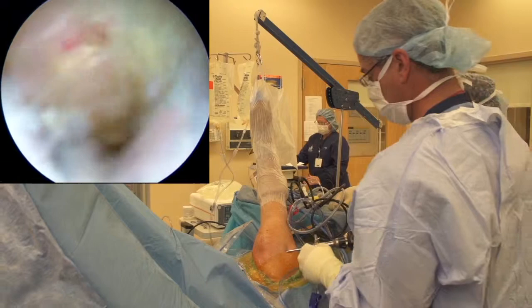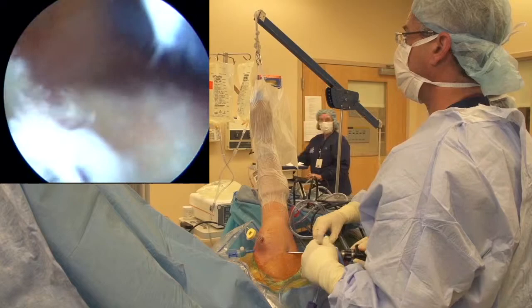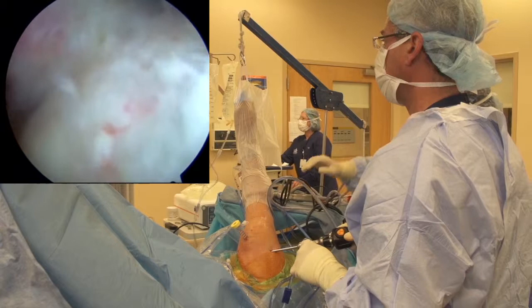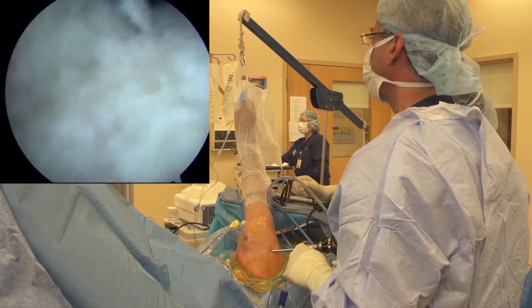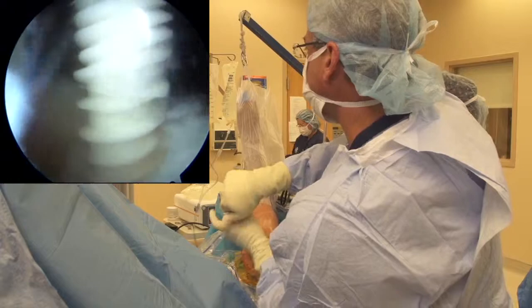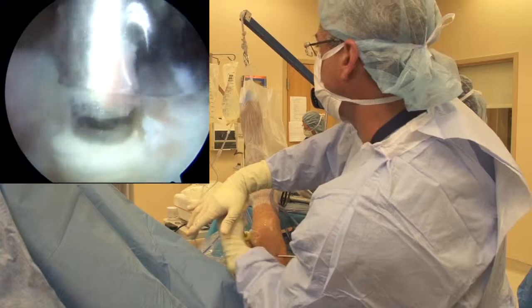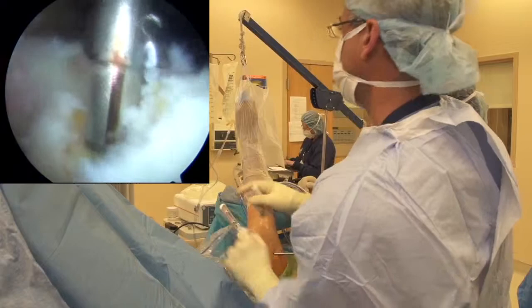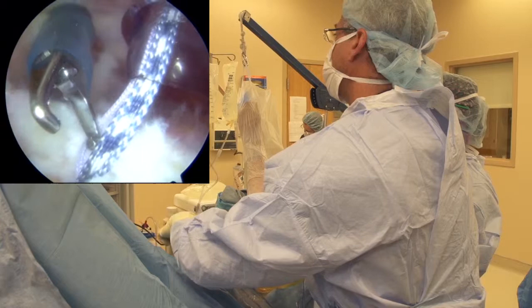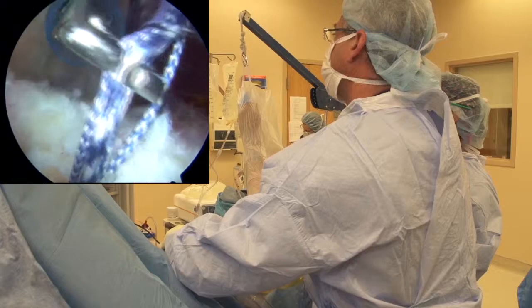We're going to go back into our posterior viewing portal. Now we've got our working cannulas here - just going to clean it up a little bit. You may want to put a shaver in here to get the debris field clean. You can see we're getting some nice bleeding there through our bone vents - some marrow material coming out as well. We're going to put our anchor here into the center of our footprint. This is a triple loaded 5.5 Mitec Helix Advance anchor. Getting excellent fixation - I'm very pleased with that.